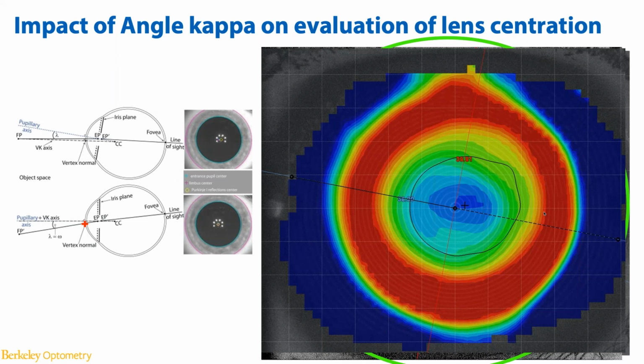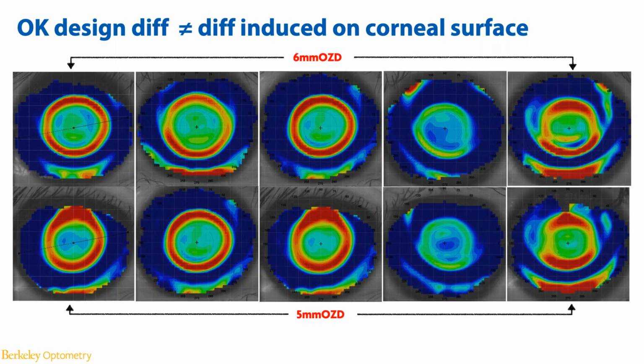Yeah, setting expectations with both the patient and parents is so important. And that actually brings up a good question as well with the 5 mm optic zone diameter size. Did your patients in the clinical study notice an increase in glare, or would you be concerned about glare and halo increasing in patients in this design?